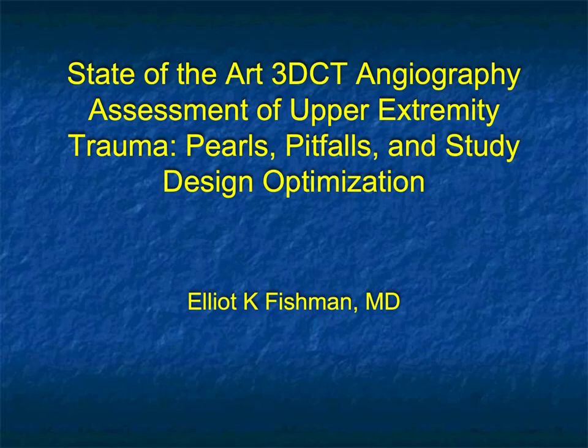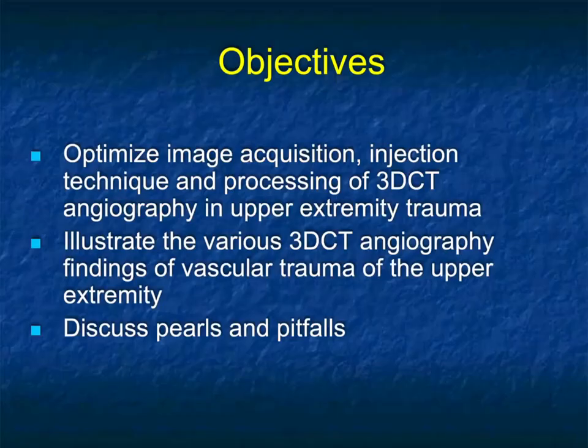And let me just go through this with you, a very simple review. I'm not going to show a lot of cases. I'm going to focus on some of the key points that were made previously that need to be re-emphasized. And I will come back with additional talks showing a lot more on cinematic rendering, for example, and looking at some of the newer things we can do with dual energy and cinematic rendering.